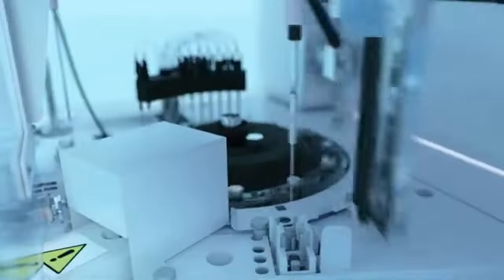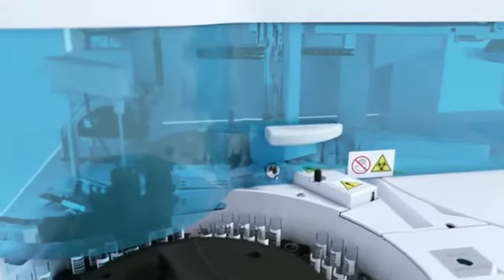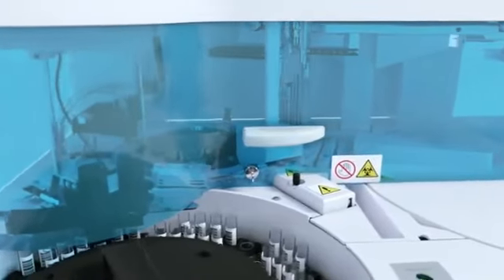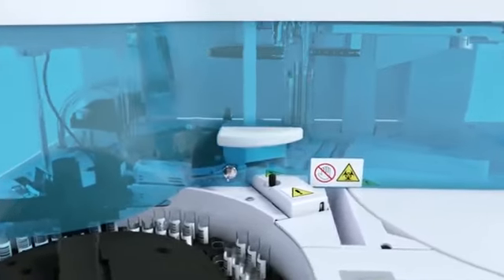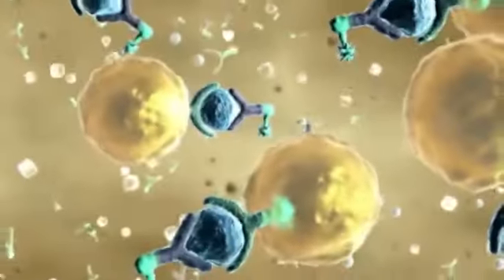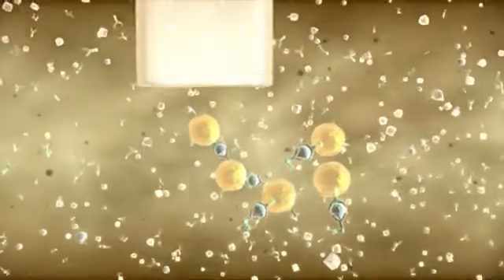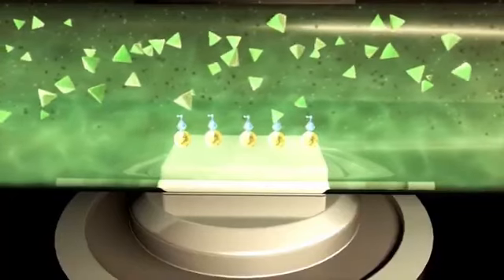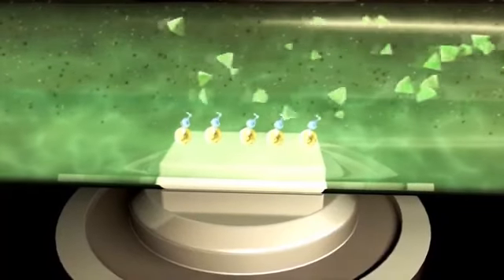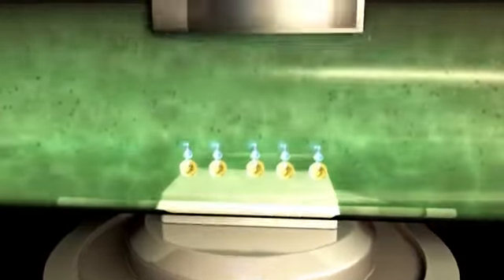After this process, a certain amount of water rinses the dispenser, and then the reagents stored inside the machine are released into the reaction vessel. The new mixture attained is carried out in either of the two areas, colorimeter or flow cell. If the mixture goes to the colorimeter, the absorbance can be measured there while it remains in the reaction vessel. In the case of flow cell, the mixture is sent to flow through the colorimeter to measure the absorbance. This way, the analyzer can calculate the relevant concentration.